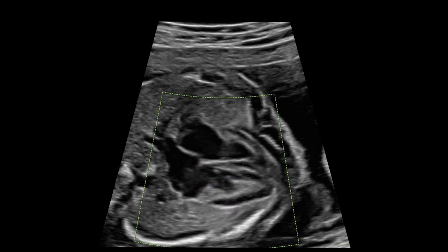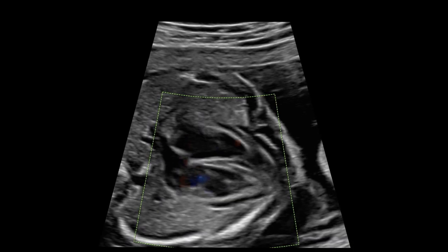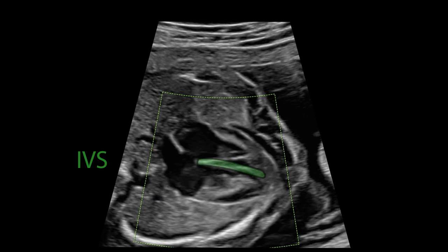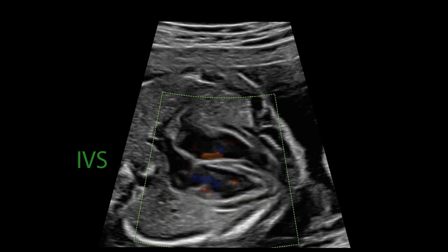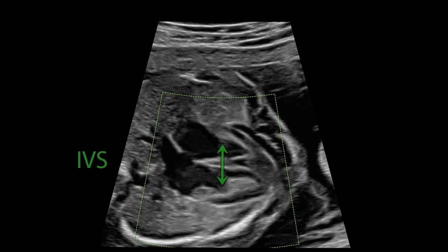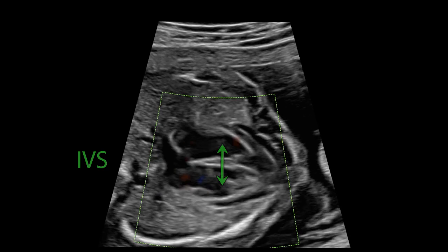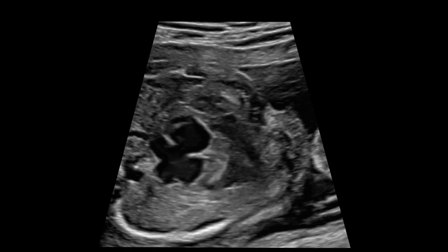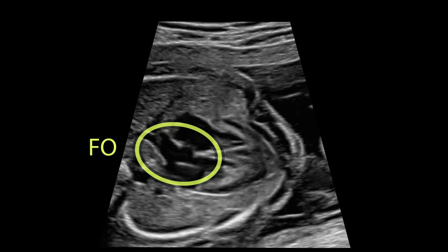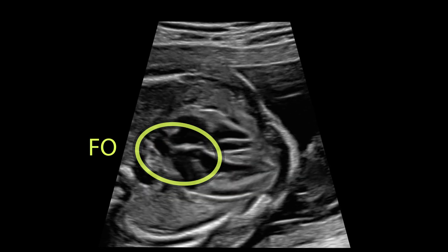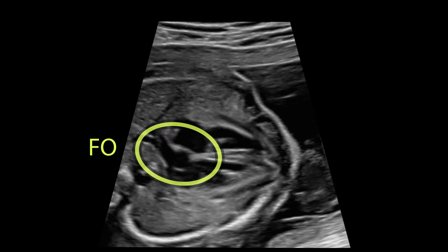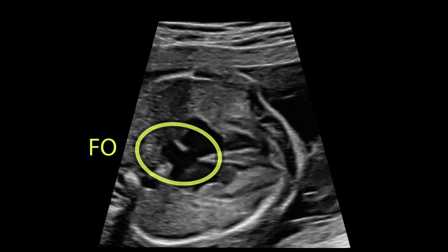In the lateral view, the interventricular septum is evaluated. The absence of flow indicates its integrity. Here we see the septum primum and the foramen ovale with its flap valve moving freely into the left atrium.